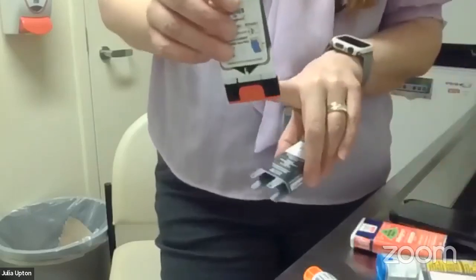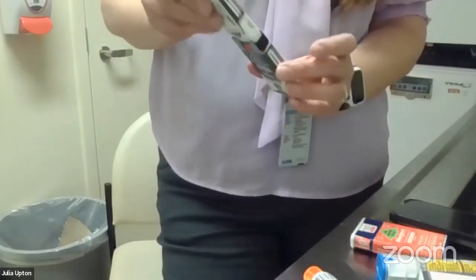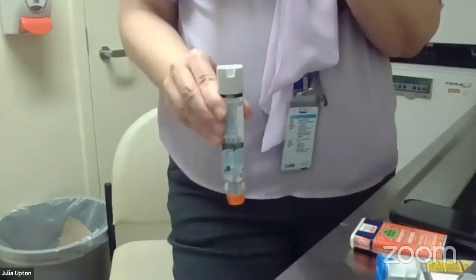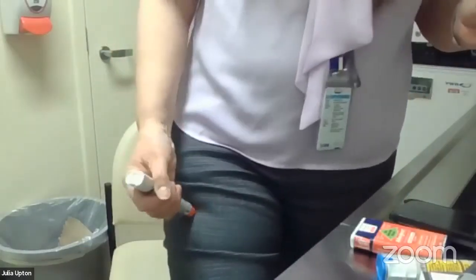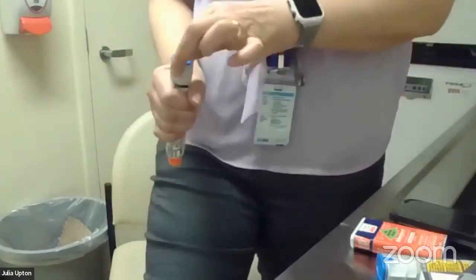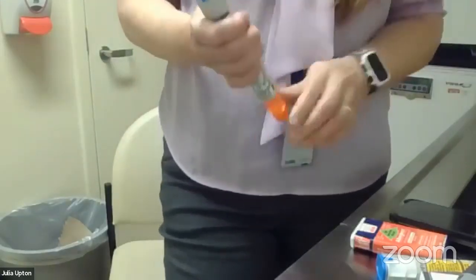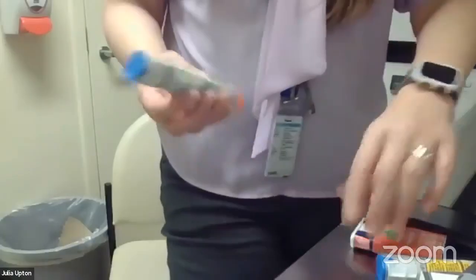I just really want to highlight that the part where the needle is in this one is what you're removing, whereas on the EpiPen, it's the back that you're removing. By removing this pin, you're allowing it so that when you push on the front, it can trigger the spring. If this blue bit is on and I try to trigger the spring, it won't trigger, see? But if I pull the blue bit off and then I push, you hear that click. So you're taking the back off the EpiPen, and you're taking the front off the Allerject. That's the main difference; the other differences are probably evident, but I really like to highlight that.